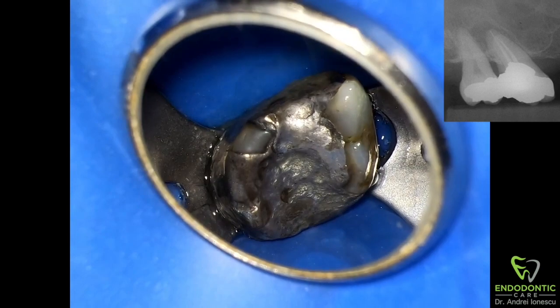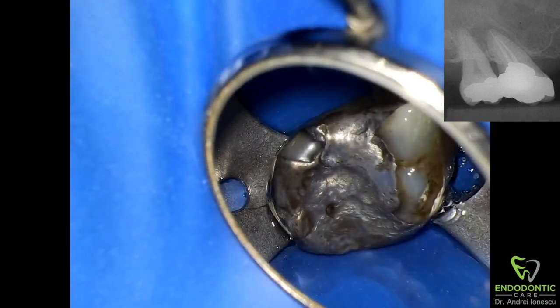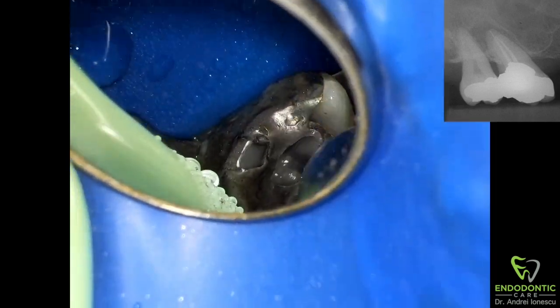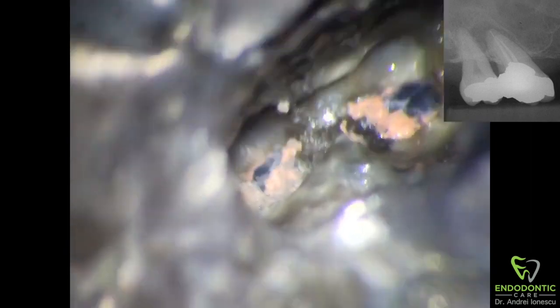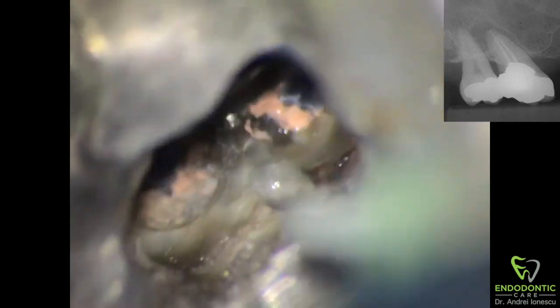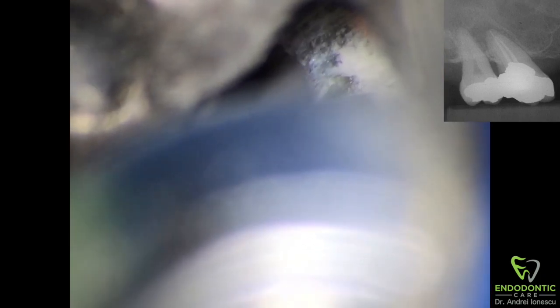As you can see, the tooth is pretty heavily restored, and on the radiograph in the top right you can see the root has a conical shape. So we're looking for a long and narrow pulp chamber and we're going to access through the amalgam. The first thing to keep in mind is that it's very important to uncover the entire canal orifice. I like to make sure I remove all portions of restorations and undercuts blocking direct view of the canals, so in this case I'm removing a little bit more structure between the mesial buccal and palatal canals.